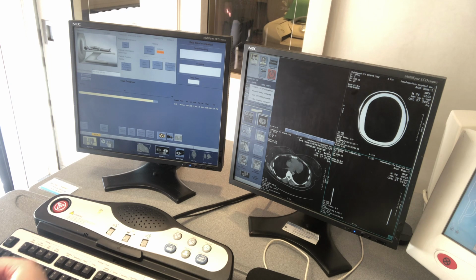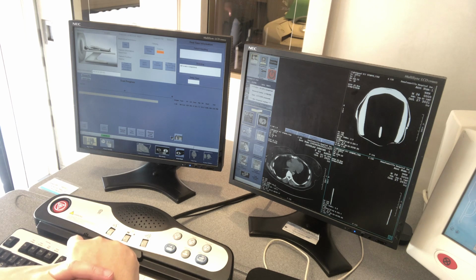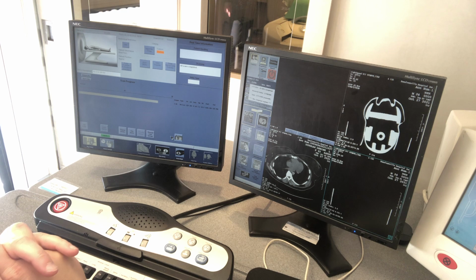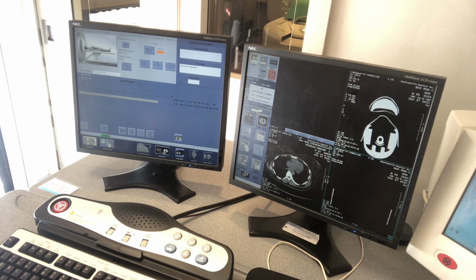So you're looking through your images to make sure there's no motion. And again, if there is, you at least need to repeat once. Let's not do any more repeats than that. And again, that would go back to the repeat series. So we're going to pretend everything is there. So over here on the left screen, you're going to hit end.